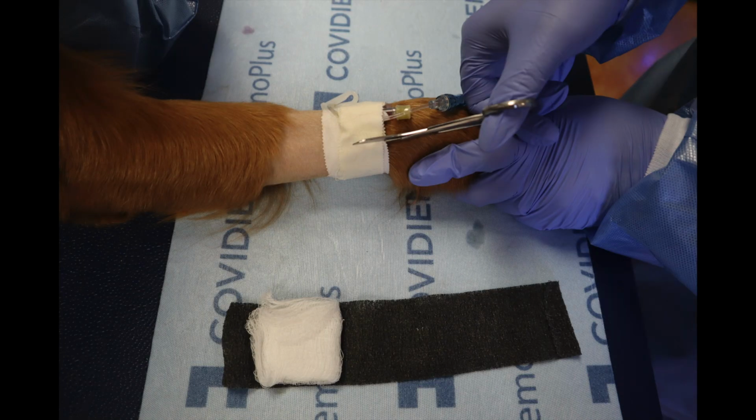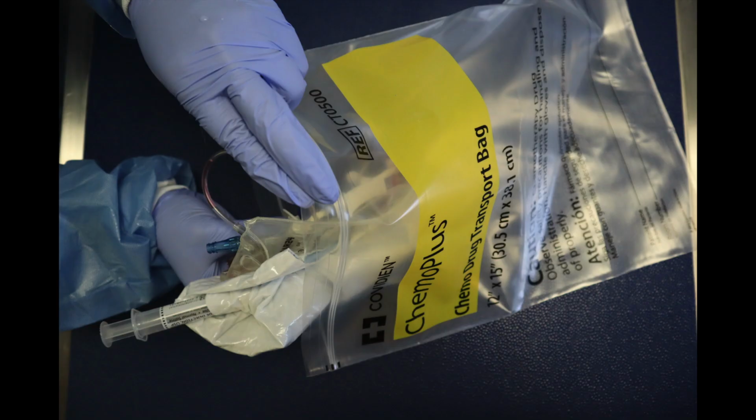Finally, remove the IV catheter from the patient by cutting the tape on the lateral aspect of the limb away from the catheter and place on the chemotherapy administration pad. Put the used chemotherapy and flush syringes on the pad. Roll the entire chemotherapy pad, including patient catheter and all the chemotherapy supplies, and place inside the provided plastic chemotherapy transport bag. Seal completely. Dispose of the chemotherapy bag as well as your gloves and gowns into the yellow chemotherapy disposal bag or bin for your hospital.